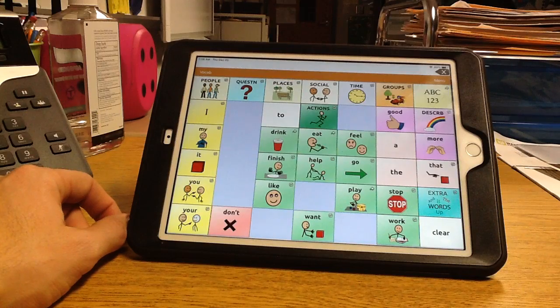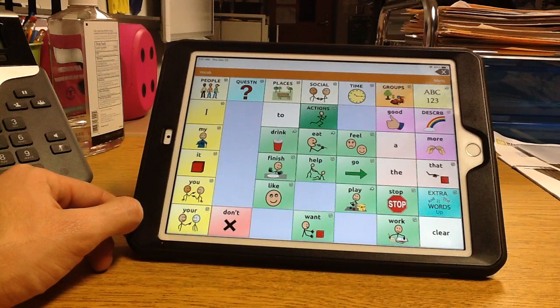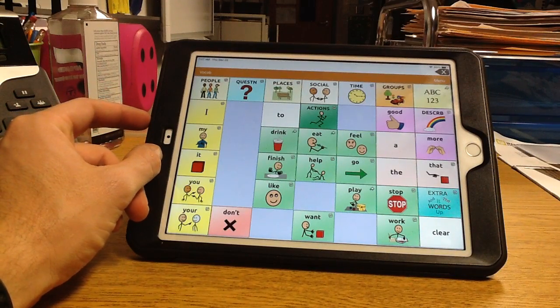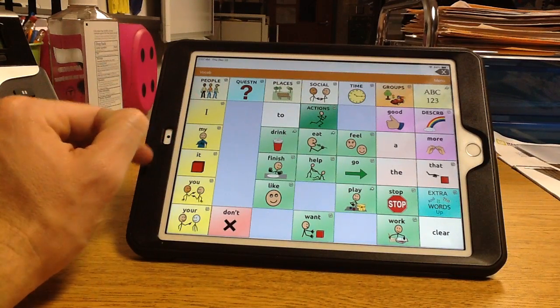I think I'll make another video with him using it and me using it, and then you'll be able to see how we get the speech out of him as a way of communication. The wonderful speech pathologists have suggested that I communicate with him on this device, so he's comfortable with that idea.